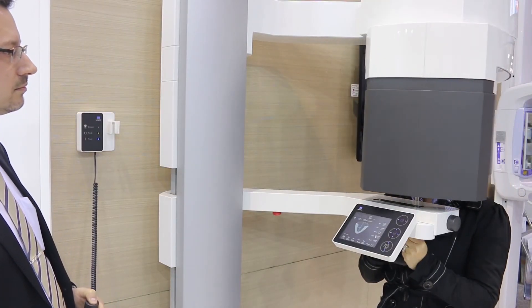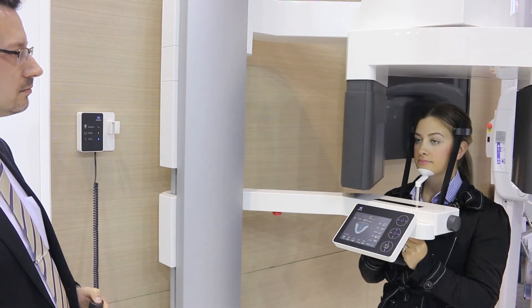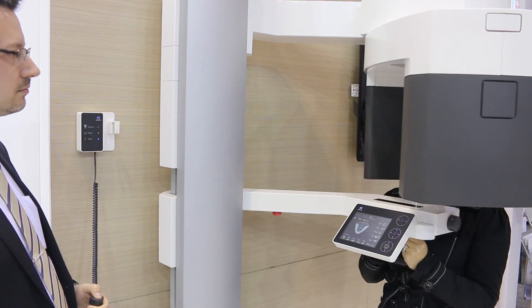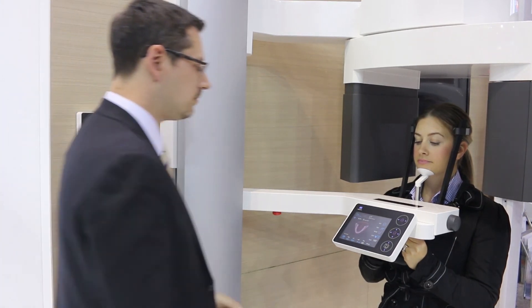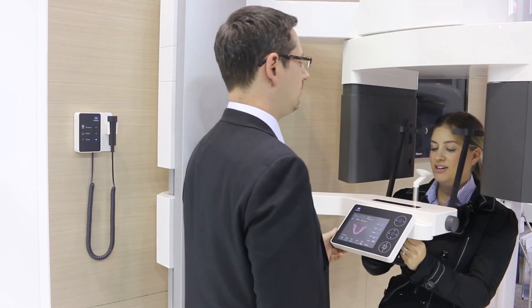Instruct the patient to remain still during the scan. Select the exposure switch and then press and hold the exposure button for the duration of the scan. Once the scan is complete, release the temple stabilisers and guide the patient away from the unit.